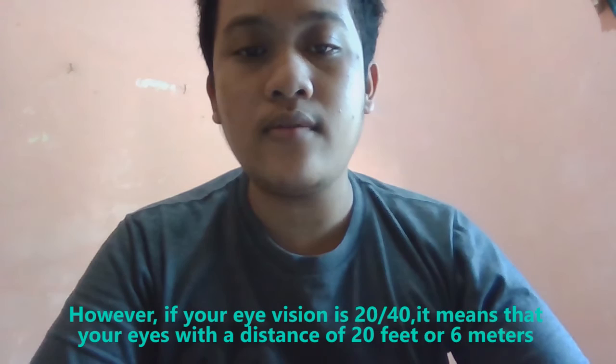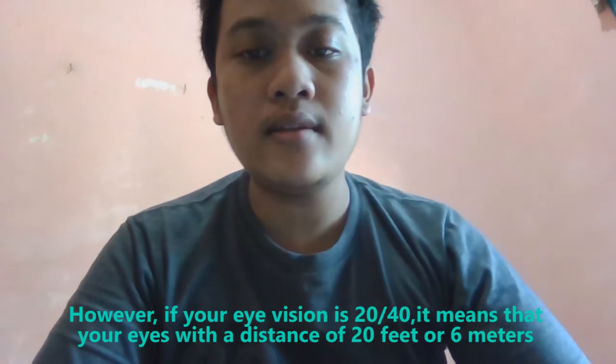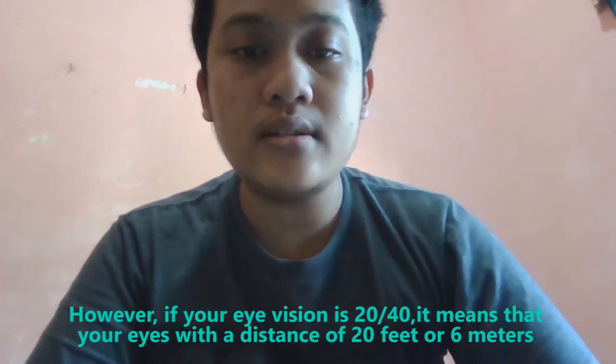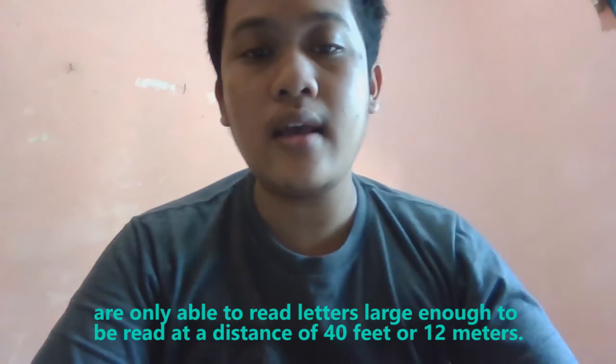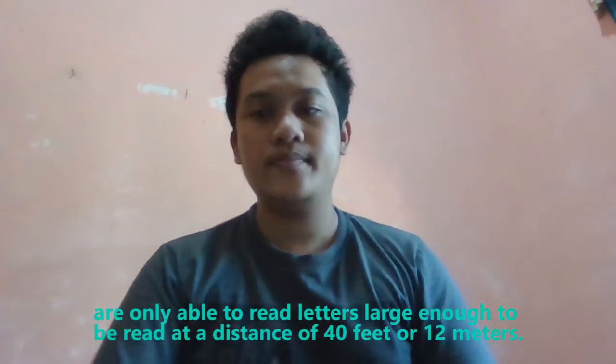However, if your eye vision is 20 per 40, it means that your eyes at a distance of 20 feet or 6 meters are only able to read letters large enough to be read at a distance of 40 feet or 12 meters.